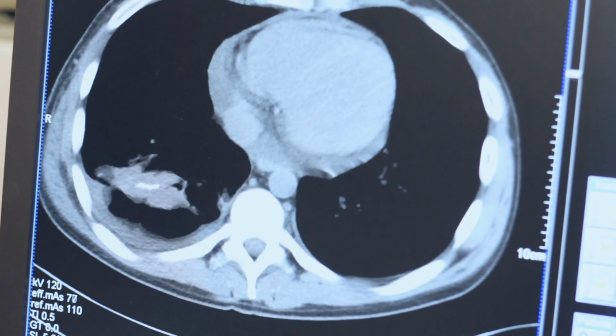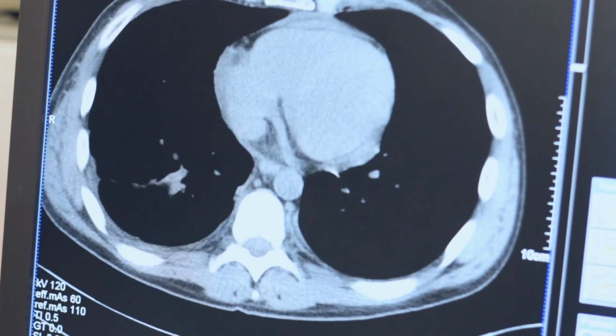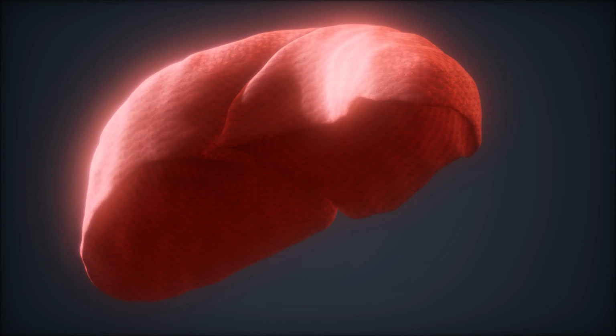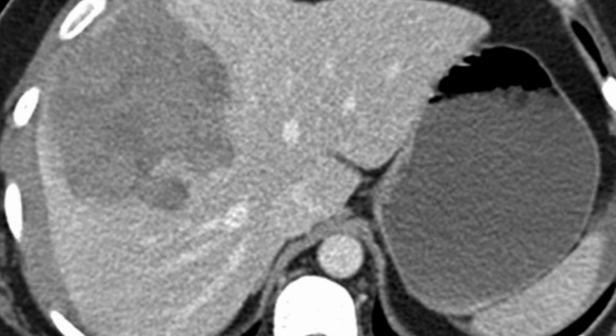So depending on your clinical task, you might be interested in covering the heart. The movies I have today just have a little picture of a heart in place of the patient. But you might want to cover the brain, the liver, chest, abdomen, pelvis. There are a whole bunch of different types of scan you might be interested in, and for each of them you might want to select the optimal scan type.